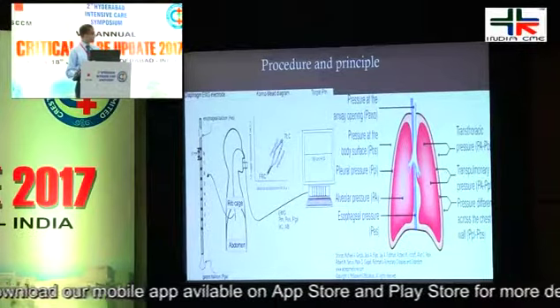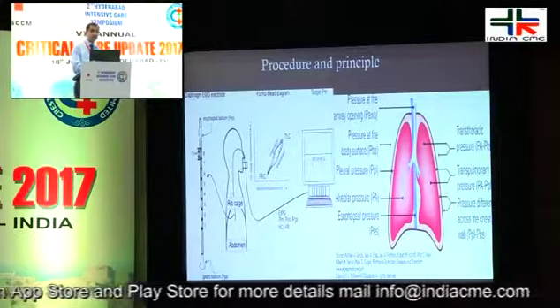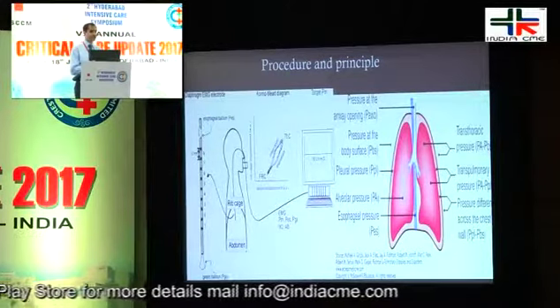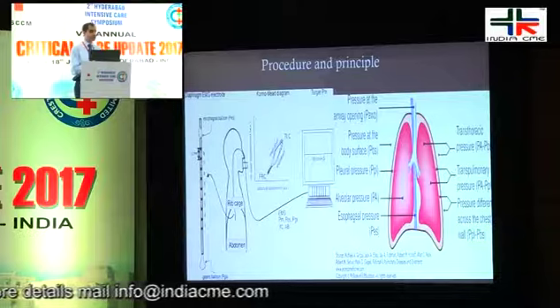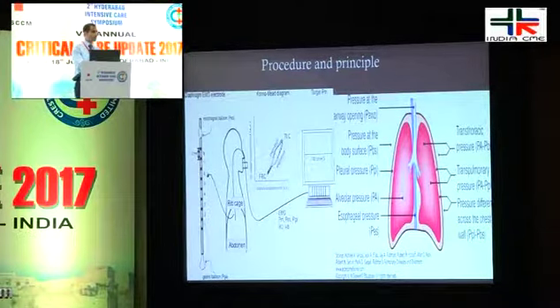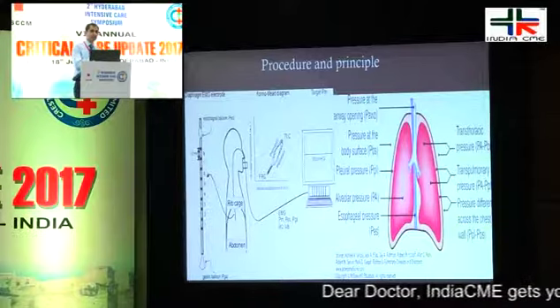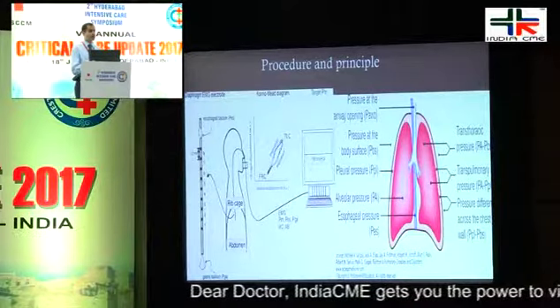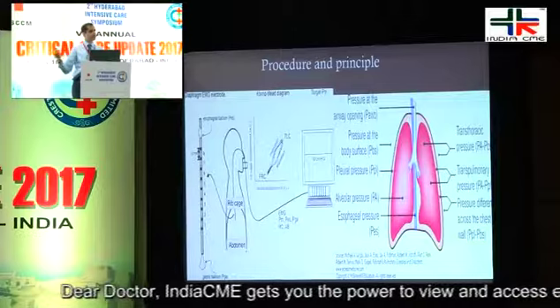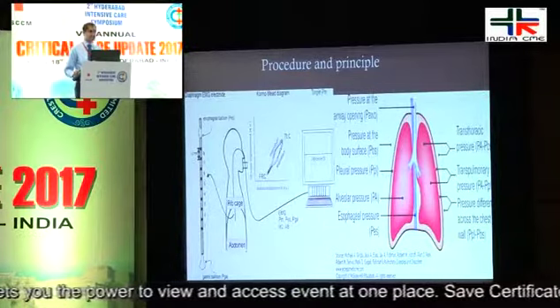The third aspect is when you give some sort of thoracic pressure or increase the thoracic pressure by a maneuver such as expiratory occlusion, and you find that the airway pressure goes up by 5, and the esophageal pressure also climbs by the same amount. It could mean that the esophageal pressure is exactly reflecting what the airway pressure is showing. So you got the three things, right?